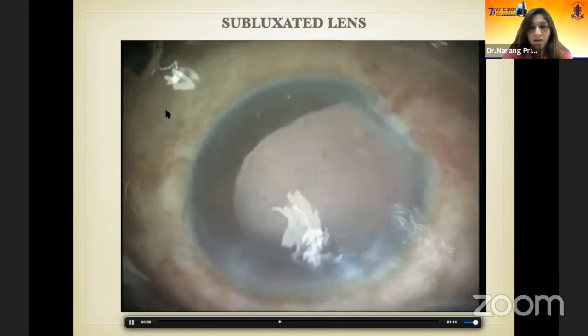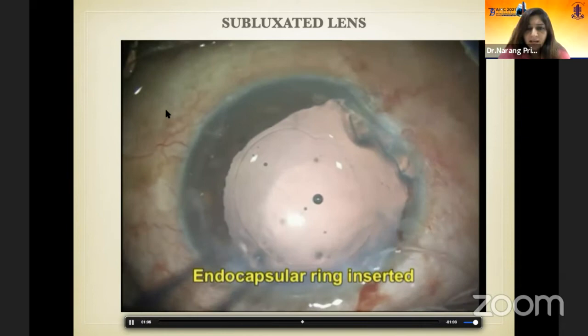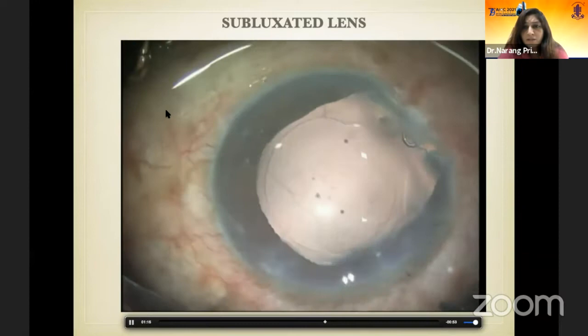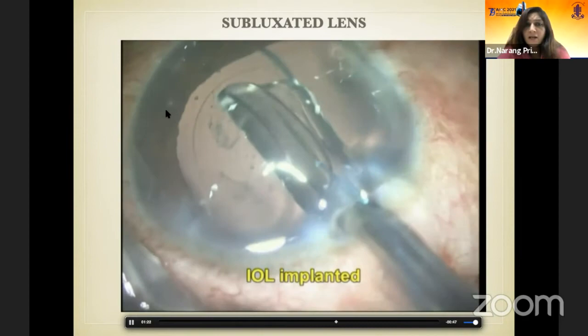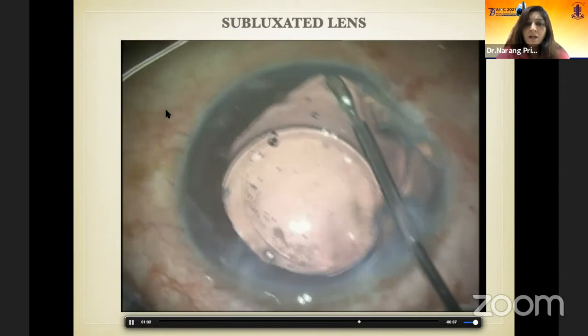So this case seems to be quite simple, and you can just go ahead and place the capsular ring inside the capsular bag. That works and helps in distension of the capsular bag at that point of time. And you have to be very careful when you slip this capsular tension ring inside, because once it goes inside the capsular bag and into the equatorial area, it's very difficult to get it back. So when it goes inside, it's always there. Secondly, I prefer to use a three-piece intraocular lens for one simple reason, that in case I come up with any other subluxations or any other complications in future, I can convert this case directly into a glued IOL procedure.